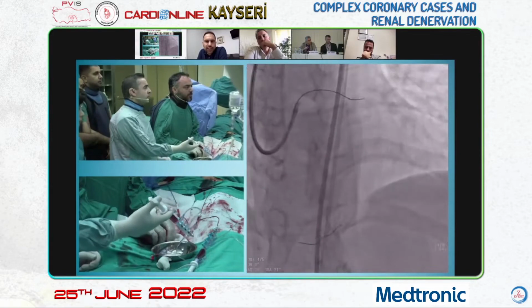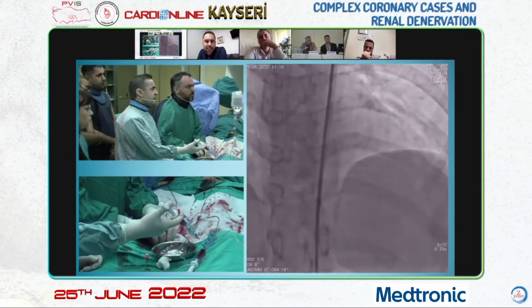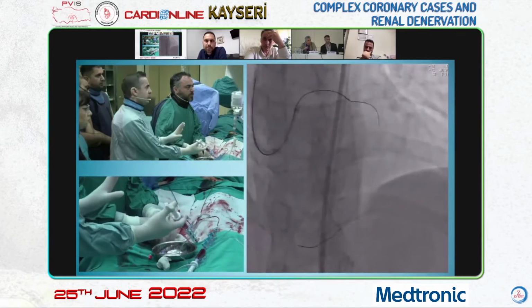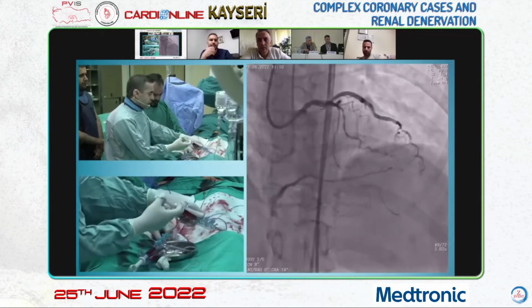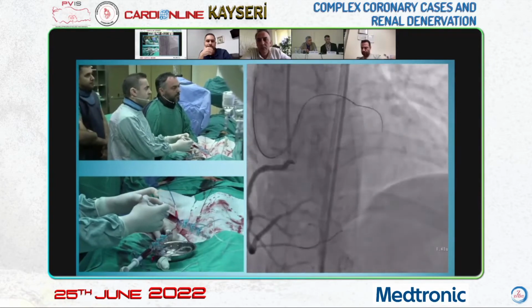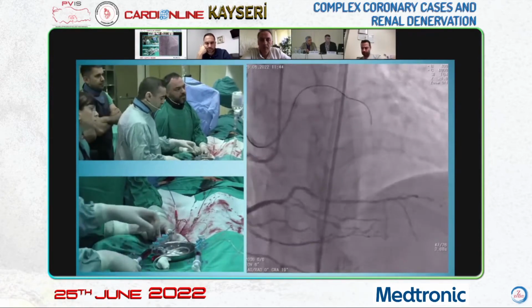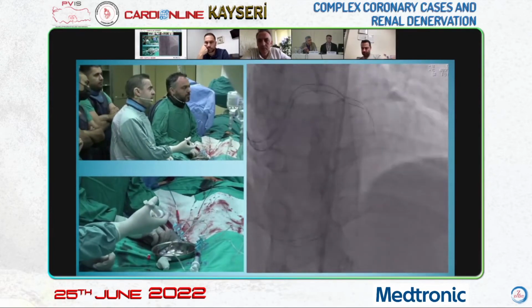Instead of continuous drilling, do you prefer sliding? Changing the direction of the wire? Yes, very good. With the sliding, we are getting a retrograde image now. Depending on the wire movement, we will understand the place.